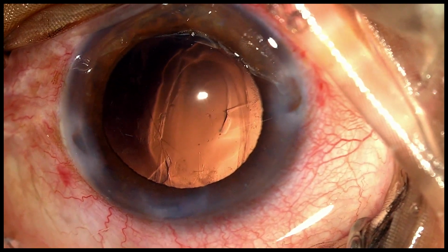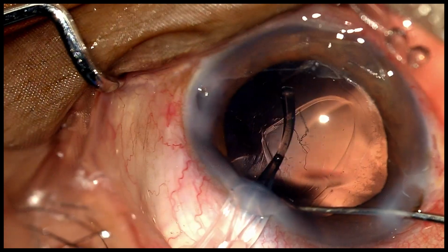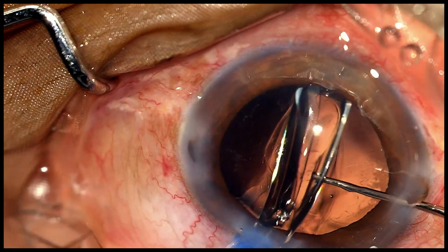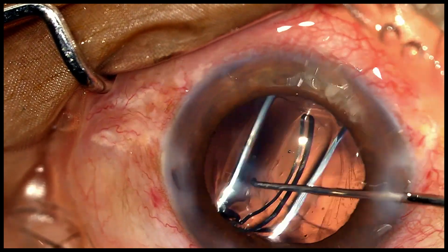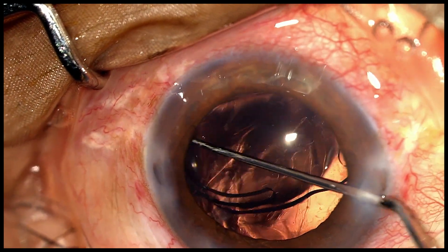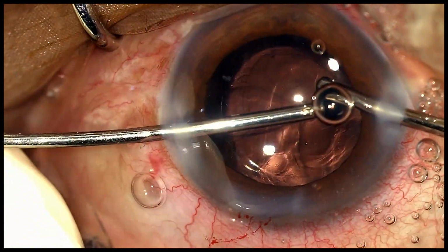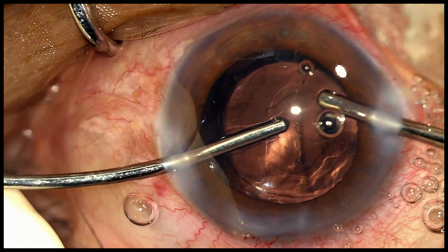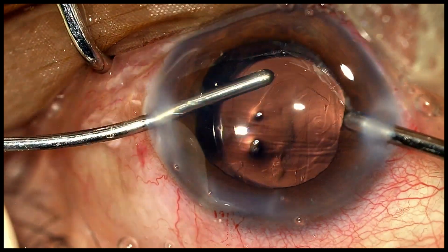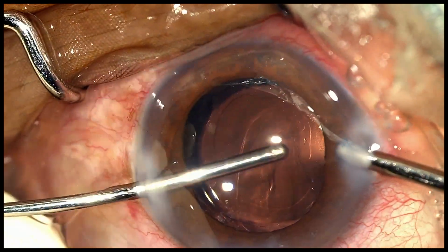Having achieved this, it's now time to implant the monofocal IOL within the capsular bag. Why did I choose a monofocal IOL? Because I have a fairly localized central tear in the posterior capsule. So having introduced the IOL within the capsular bag, I now rotate it to assume a horizontal position. Having completed the insertion of the single-piece monofocal IOL in the capsular bag, a careful and a gentle visco wash is done to remove the viscoelastic from the anterior chamber. No excessive rock and roll movements should be made of the IOL in a compromised case like this.